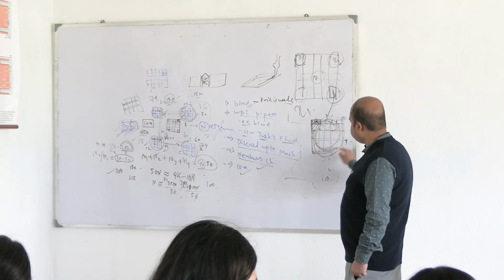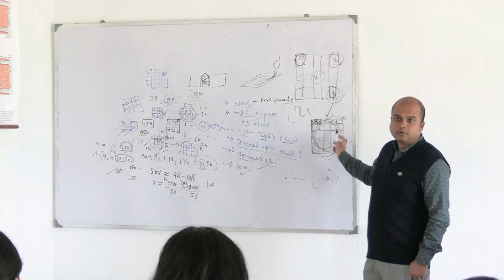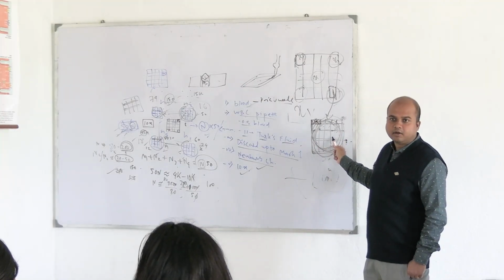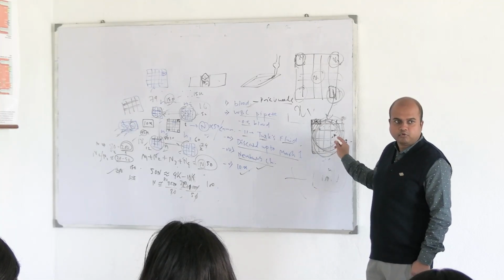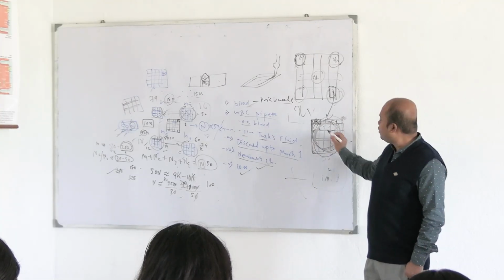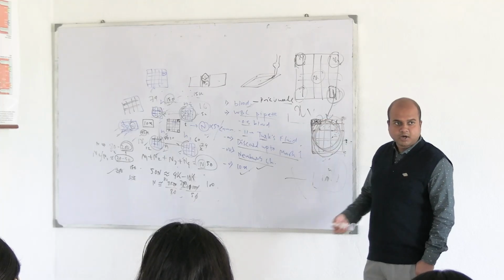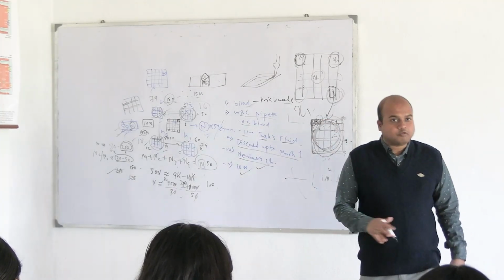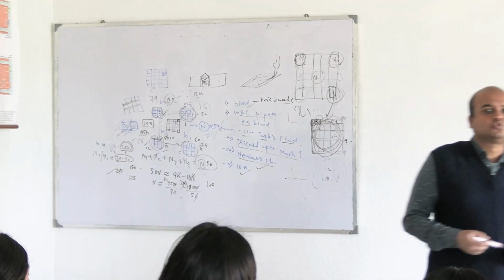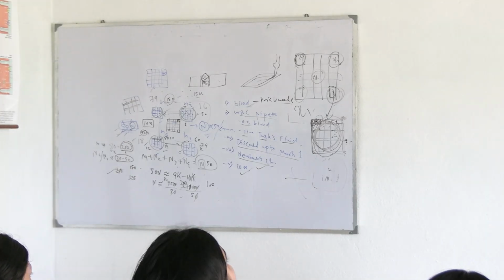What is the number of small squares in each of the medium squares? It comes the same, 4 into 4, 16. So what is the volume of each small square? If someone asks, you have to tell, it is not volume of squares but volume of blood overlying the squares. The area of each small square is 1 by 20 into 1 by 20, and the volume of blood overlying it is 1 by 20 into 1 by 20 into 1 by 10.